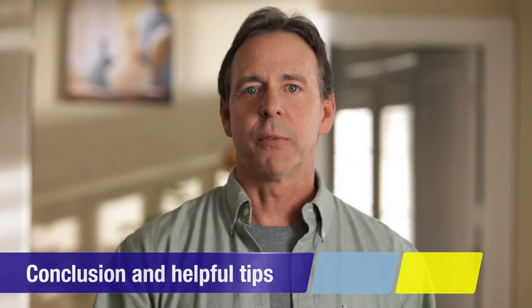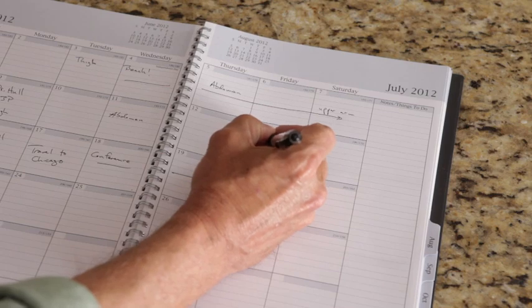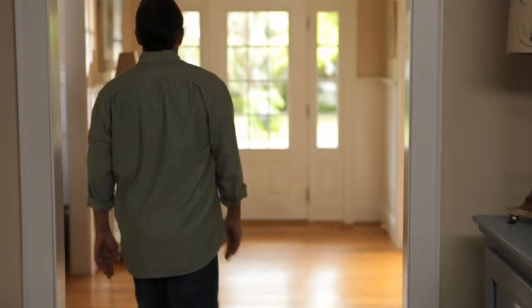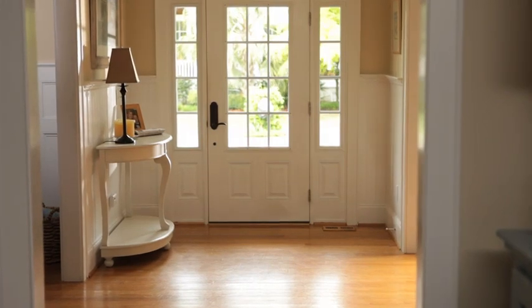Here are a couple more helpful tips. You may find it useful to jot down on a calendar which site you injected. That way you'll be able to easily decide on the best injection site for the next time. And remember that most patients have a bowel movement within a few minutes to a few hours after taking a dose of Relistor, so plan ahead to be near a restroom. Be sure to talk to your healthcare provider if you have any questions about Relistor or if you're having trouble injecting.